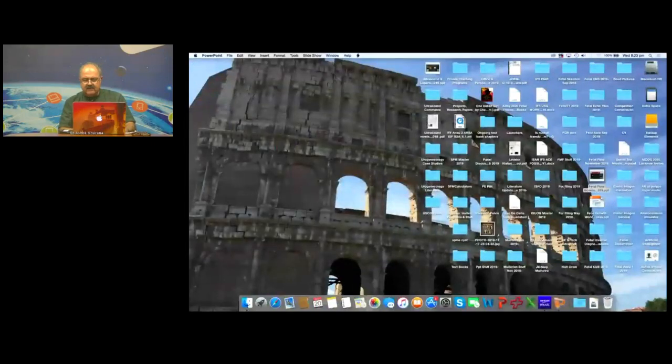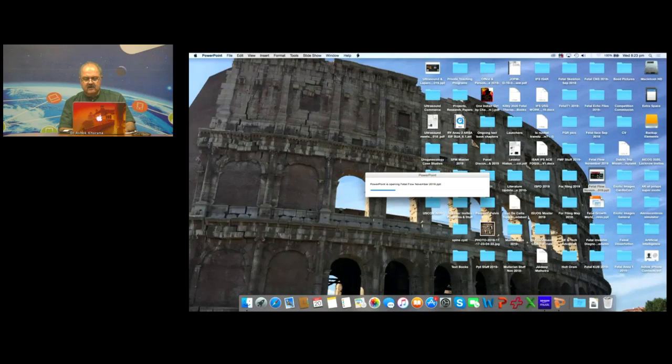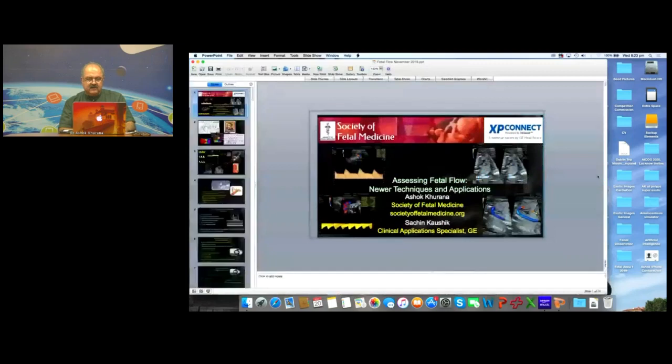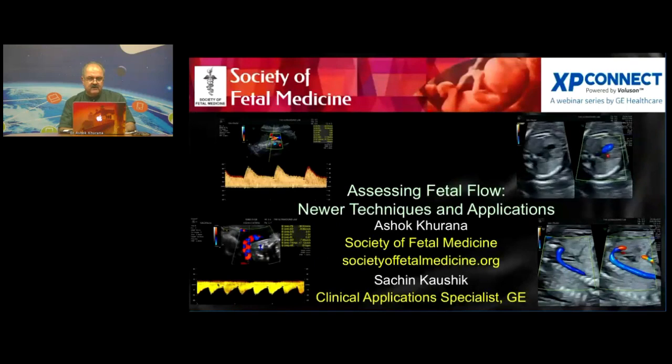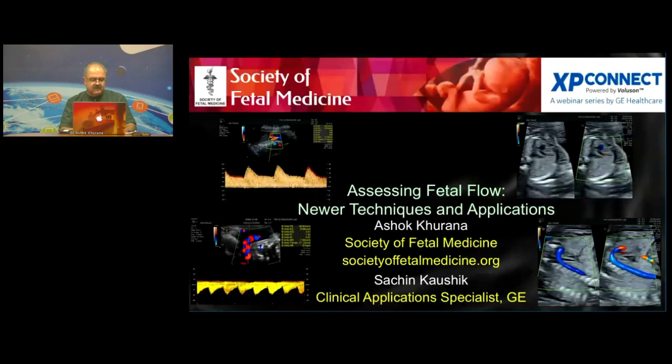So essentially what is happening is that we're learning that there is no such thing as a color Doppler ultrasound in obstetrics, or a color Doppler anomaly scan as such. Color Doppler is now a very integral part of the ultrasound examination. So that category by itself truly does not exist anymore. And we must open our mind to the fact that what we really need is something where we have the color as an option at all times. We cannot separate the two.